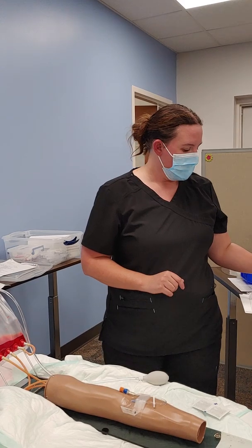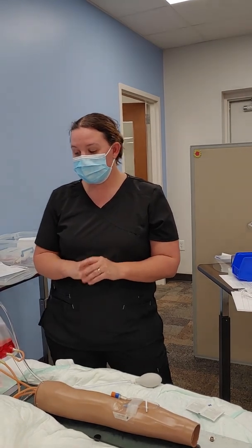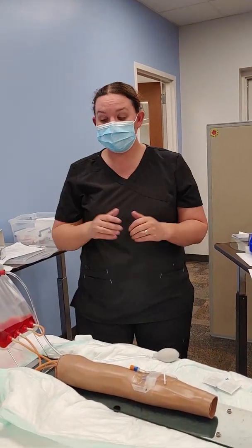Explain procedure. So what I have for you is I have your IV Lasix. This is going to go in your IV. I'm going to slowly push it in over a minute. And this is a diuretic, so it's probably going to make you have to pee. So go ahead and put your call light on if you got to go to the bathroom. Provide privacy. Ask patient about allergies. Do you have any allergies? I'm allergic to sulfa drugs.